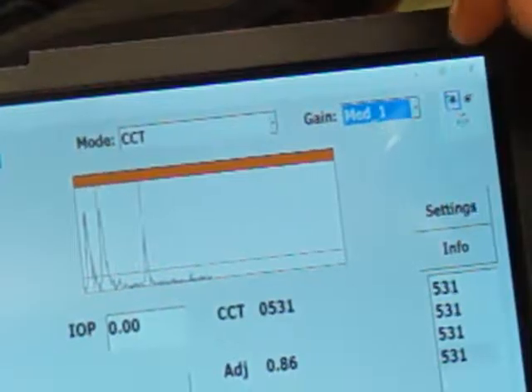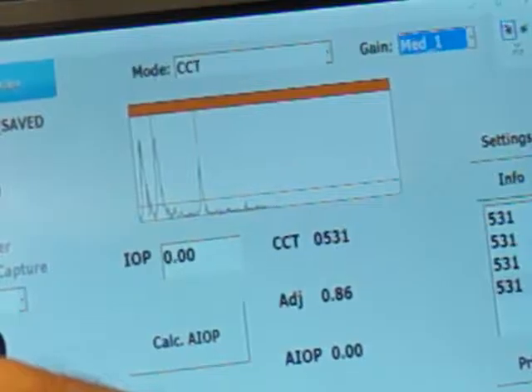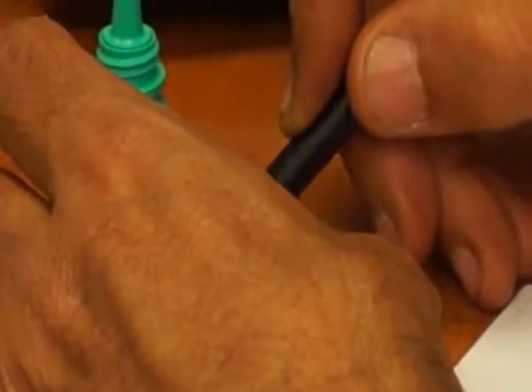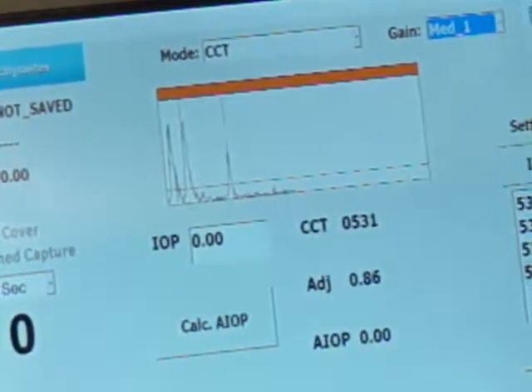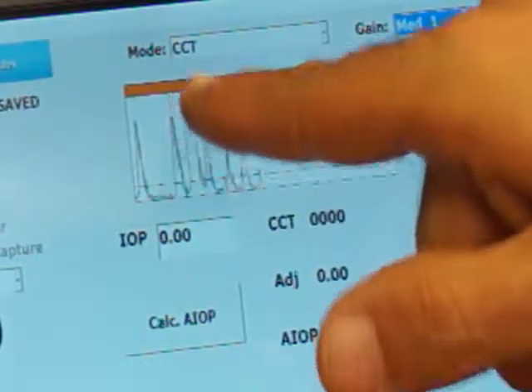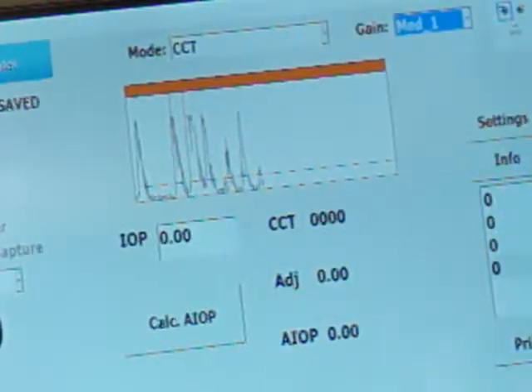So again, I usually use M1 or M2 when I do the cornea, and I always want to make sure that after I load the tip, I wiggle it a little bit so it's not stuck to the bottom, and gently lift it up, and I just check to make sure that there is no air in there, and then once I start, tip cover selected, look for multiple spikes, and when I see that, I know that the coupling is perfect.